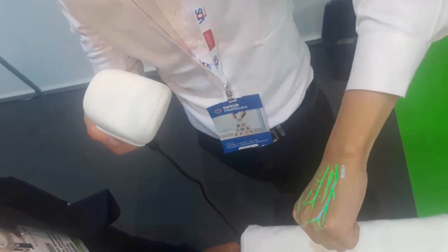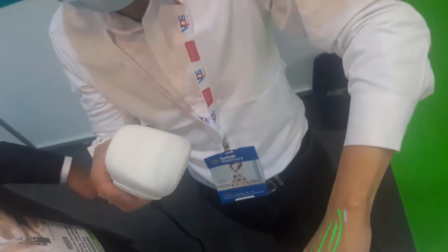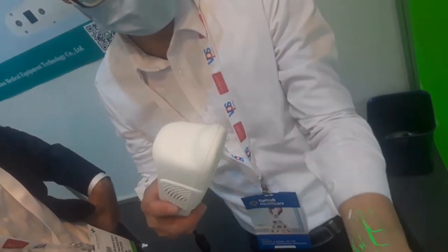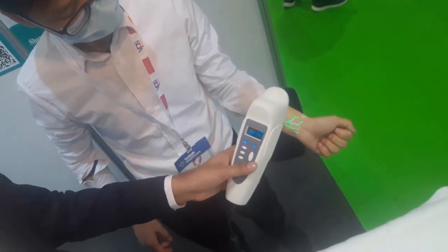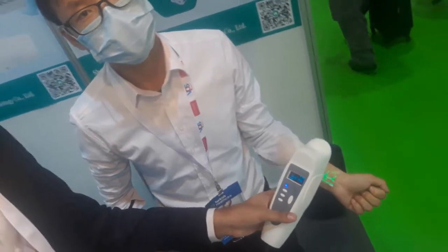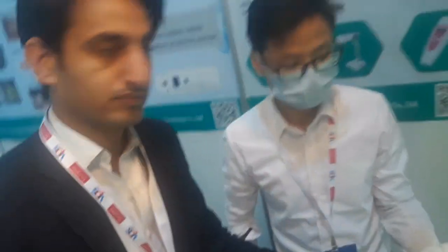This vein viewer has quite cool functions, for example virtual hair removal, projection size changes, color brightness, and dual modes. It also comes with a tabletop stand but can be used independently as well, because it is a rechargeable device. It comes with lithium-ion batteries.